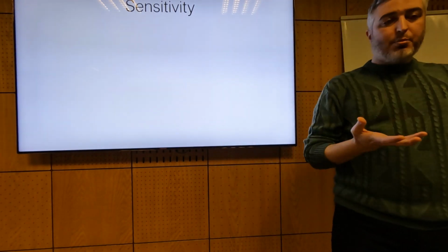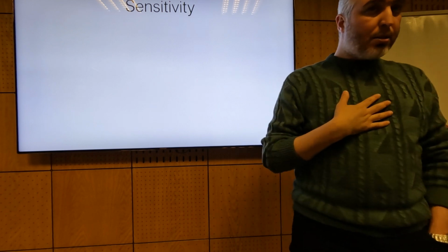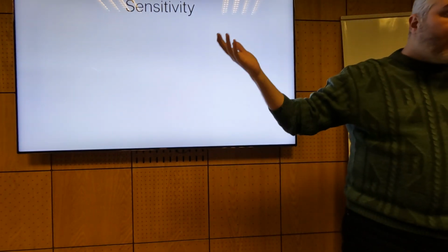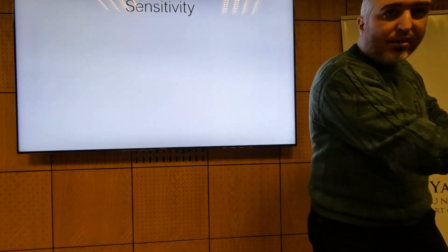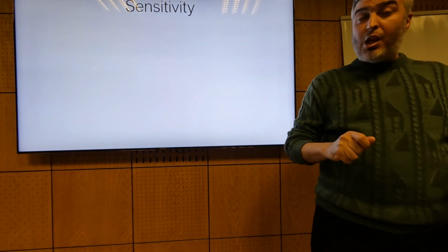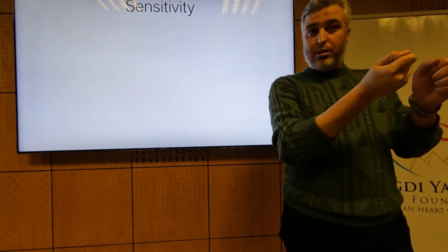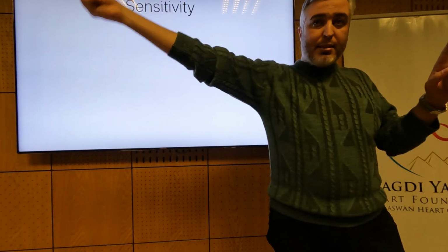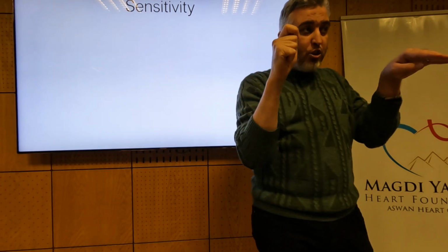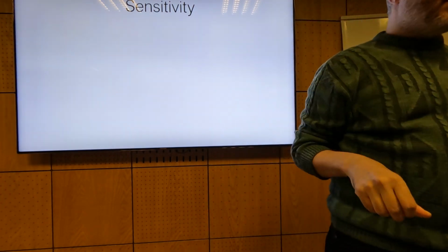Because there is lots of other noise that you want to ignore. Patients are breathing, and this movement of the respiratory muscles can mislead the pacemaker into thinking that breathing is ventricular activity, and then it stops pacing the ventricle while the patient is breathing and there's no ventricular activity. On the other hand, if you've set the ventricular output very high, the atrial lead might think that this is atrial activity. So you want to instruct the pacemaker to ignore the noise but sense the real activities.